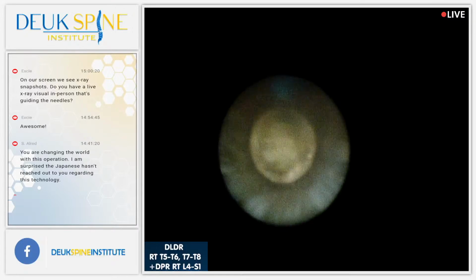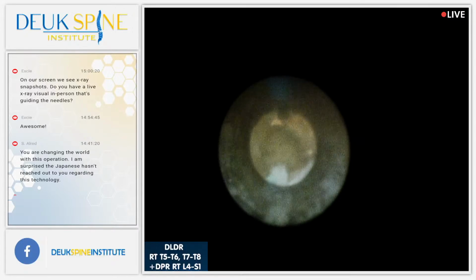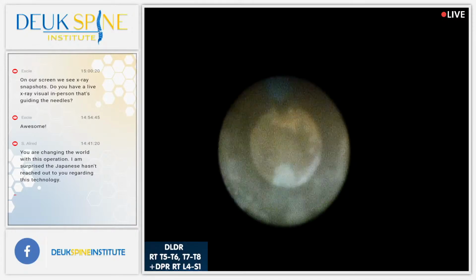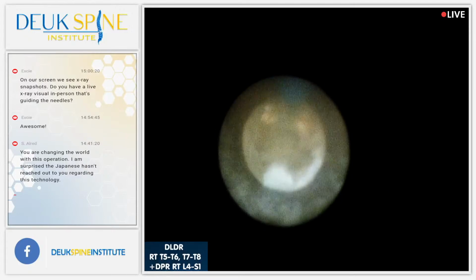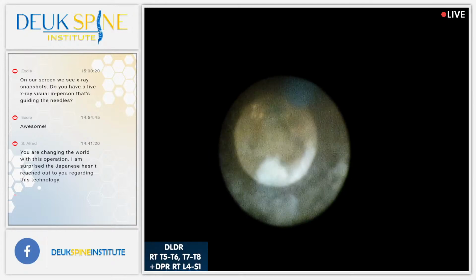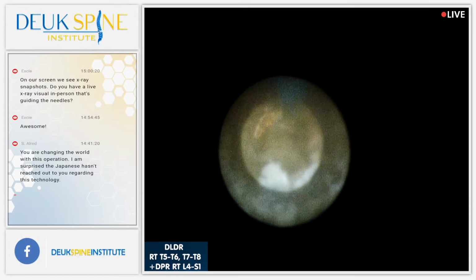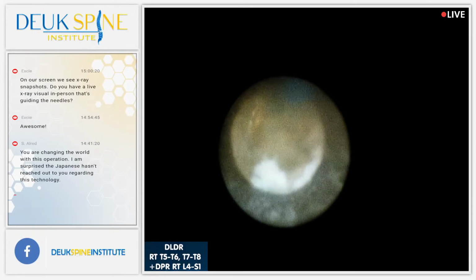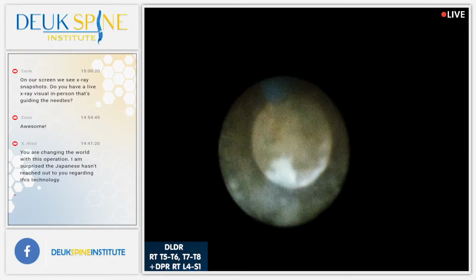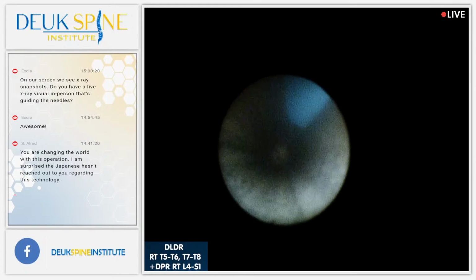All right, any questions? Yes, we have a question from XC once more on YouTube. They asked, on our screen, we see X-ray snapshots. Do you have a live X-ray visual in person that's guiding the needles? Great question. No, I use the X-ray snapshots that you get. Everything I see, you see. I'm showing you everything the surgeon sees. So those X-ray snapshots are what I use. There's no continuous video feed for X-ray.